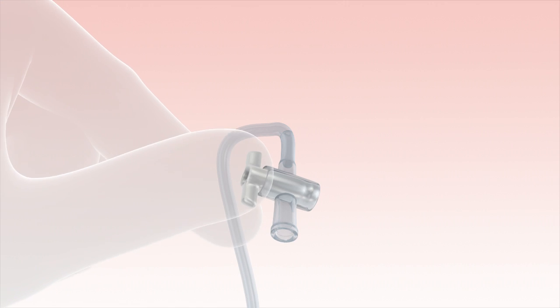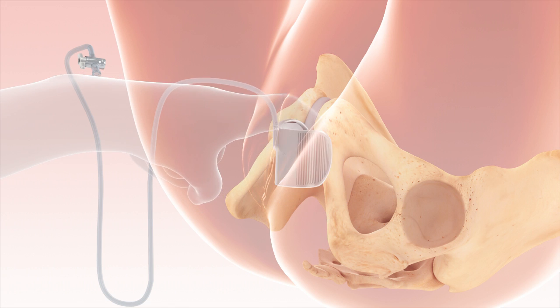After delivery, deflate the device by opening the tap. The device is removed by gently hooking the plate.